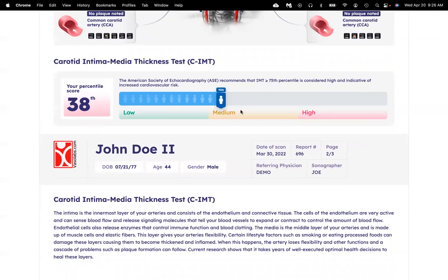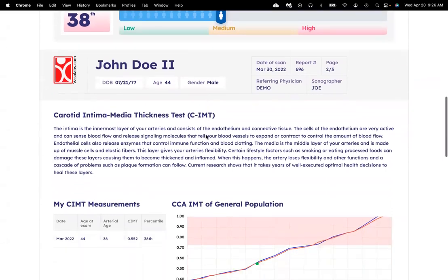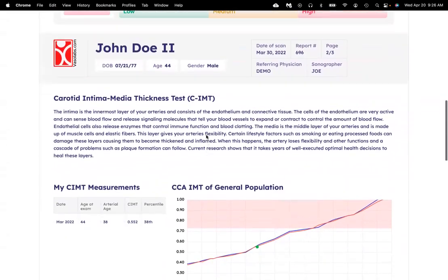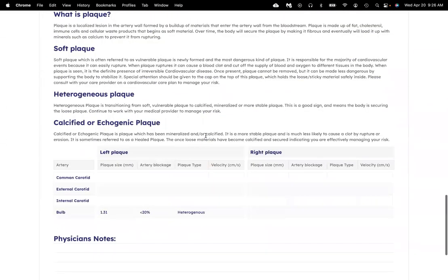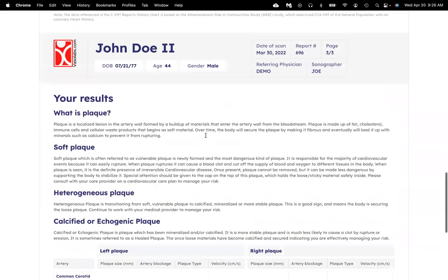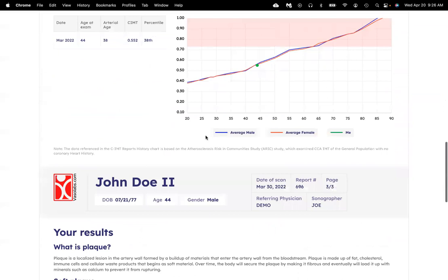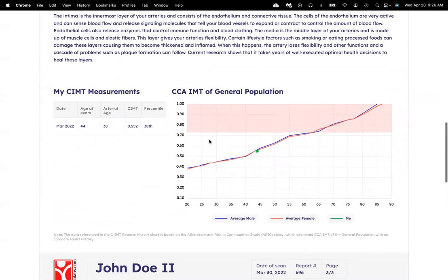IMT greater than the 75th percentile puts you at high cardiovascular risk. Next, there's a description of the different types of plaque.